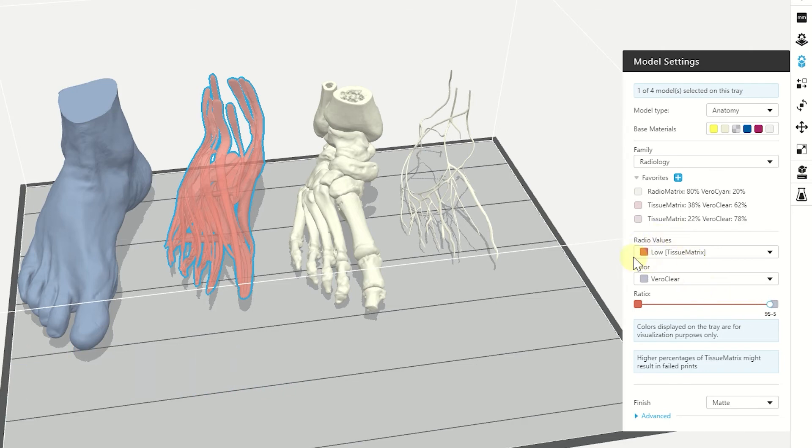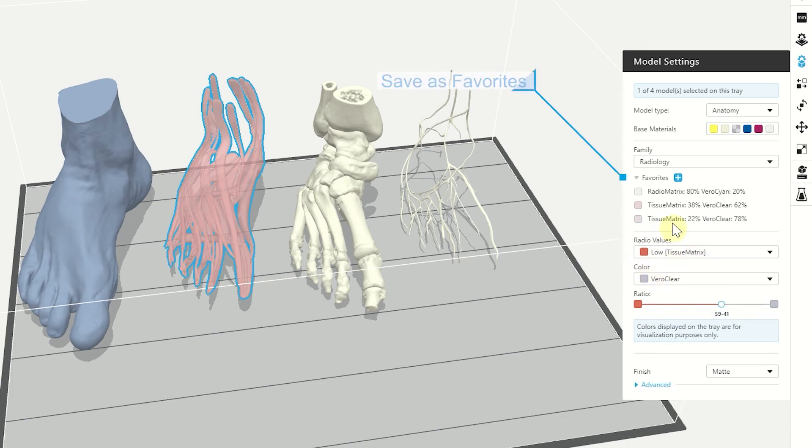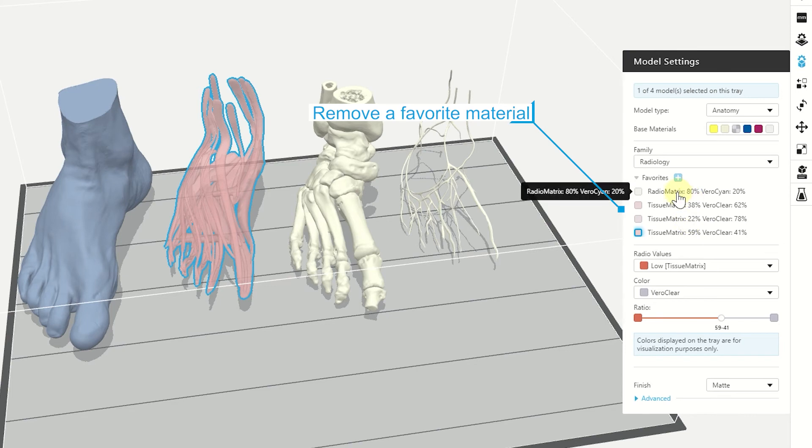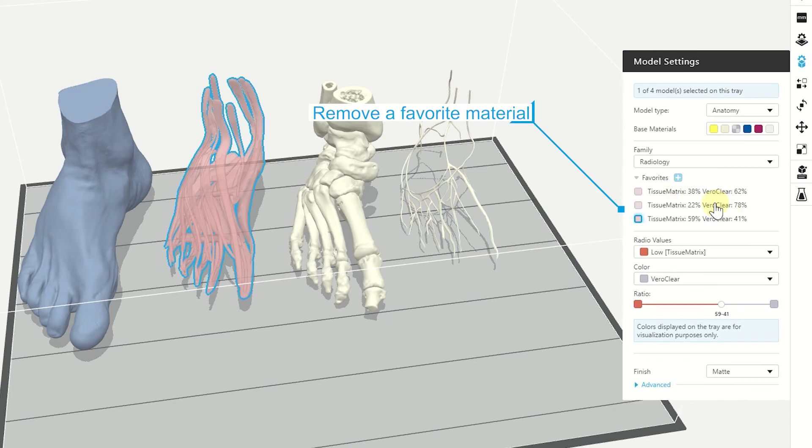If we have a mixture that we like and we want to use it often, we can save it as favorites by clicking here on the plus icon. If you want to remove one of the favorite materials, we can right click on it and remove.